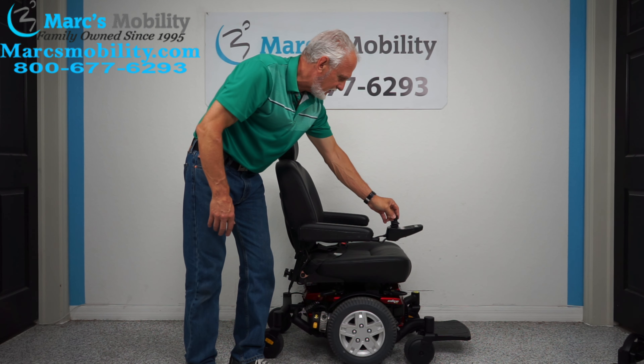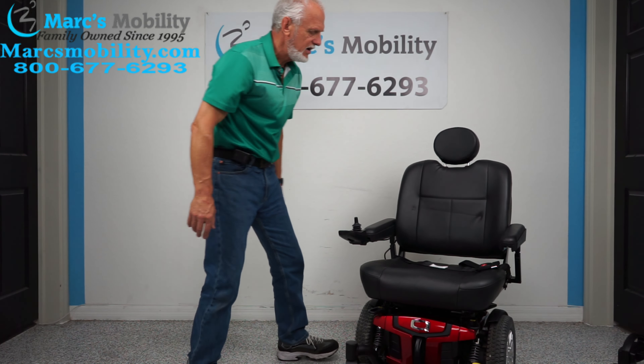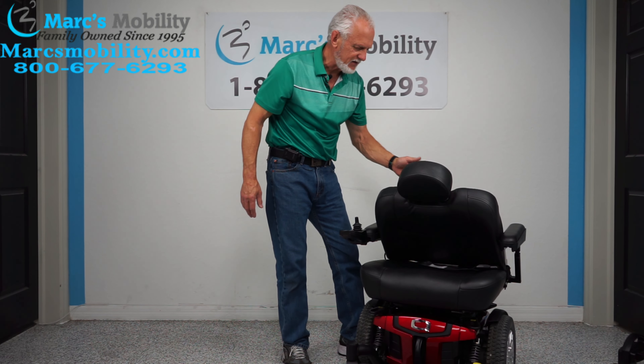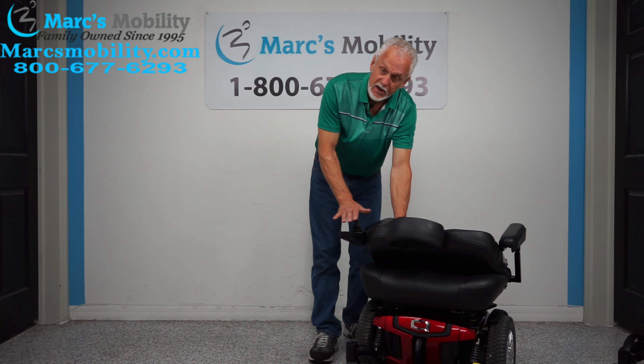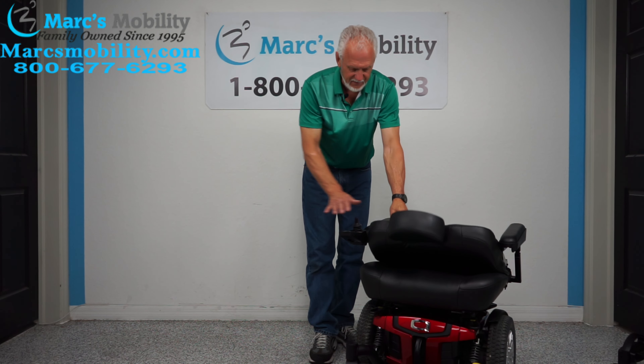Let me show you the seat — that's what's going to be really good about this chair. This is an extra large seat, it has a 23-inch wide by 20-inch deep seat. This is a flip-down seat, so if you need to transport it, your height range is about 31 inches. So if you're going to put it behind your van, that's about 31 inches — push your seat down like this.